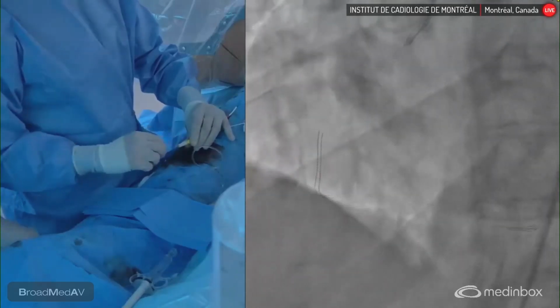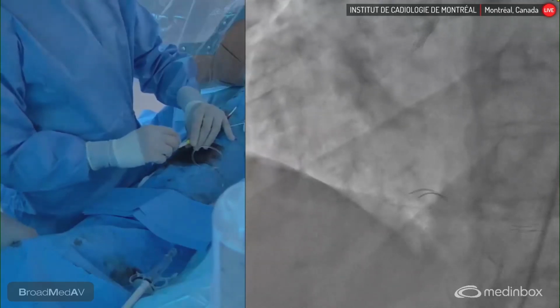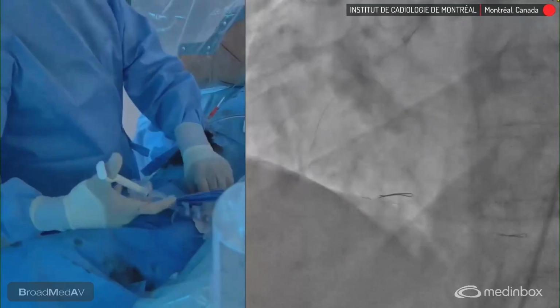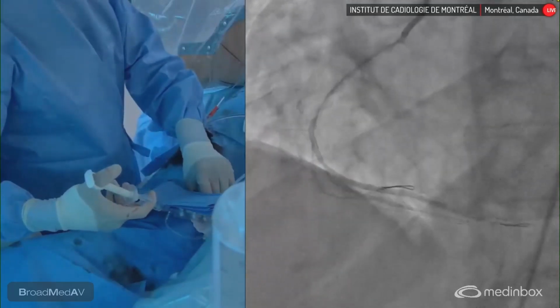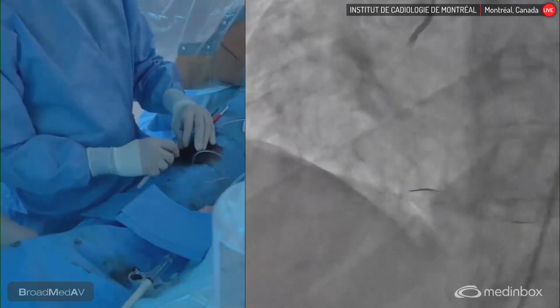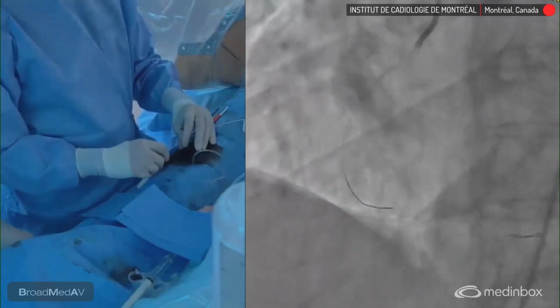That looks like the branch. I want to check here. Let's see if it's the correct branch. No, I need to come back. No, we take the 38.